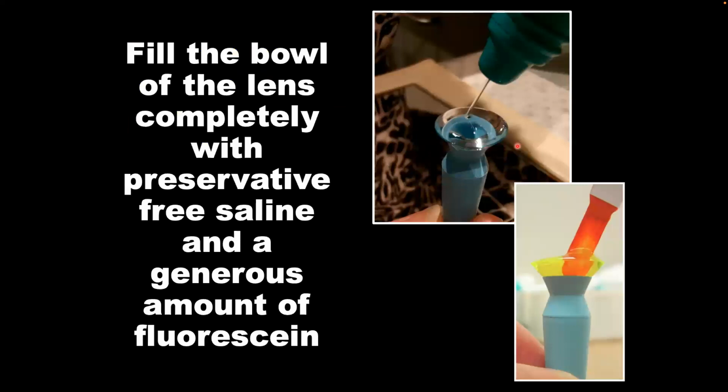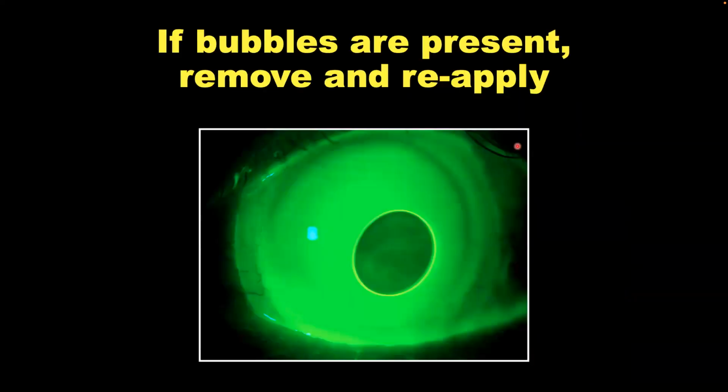So like I was telling you, just having the preservative-free saline solution and fluorescein and doing the assessment, right? If you ever see a bubble after inserting the lens, just remove it and reapply. That's something we all know about these types of bubbles.